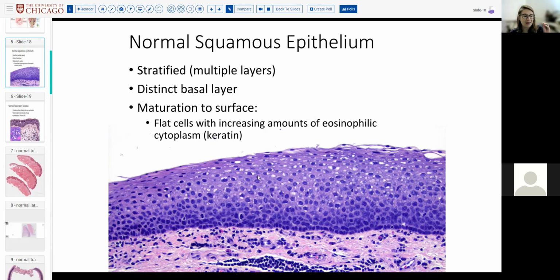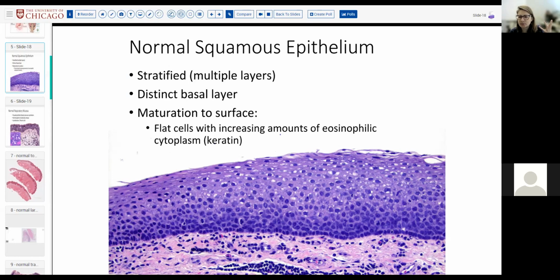And so all of the eosinophilic cytoplasm in the squamous cells is the area where the keratin resides, okay? You may see this pallor on either side of the nucleus. When you see perinuclear pallor in a squamous site, does anybody want to chat or shout out what that is? What is that? What's the paleness made up of? Is it mucin, fat? Glycogen. Yes. Glycogen. Yes, thank you guys.